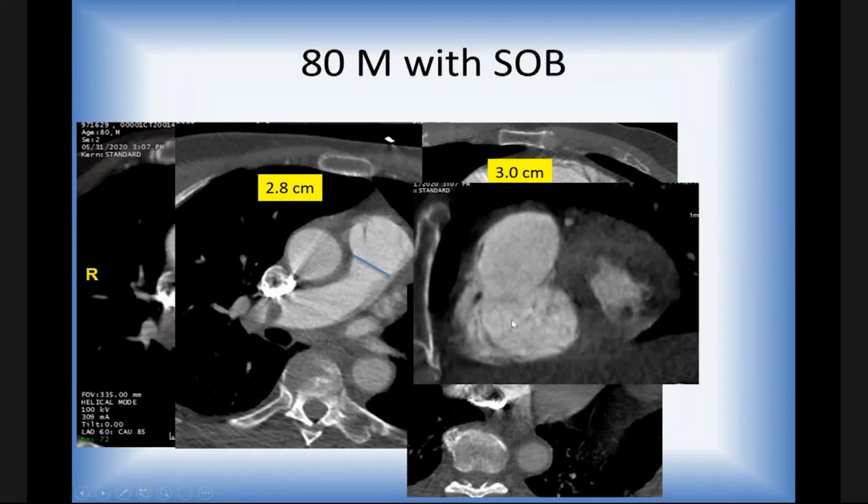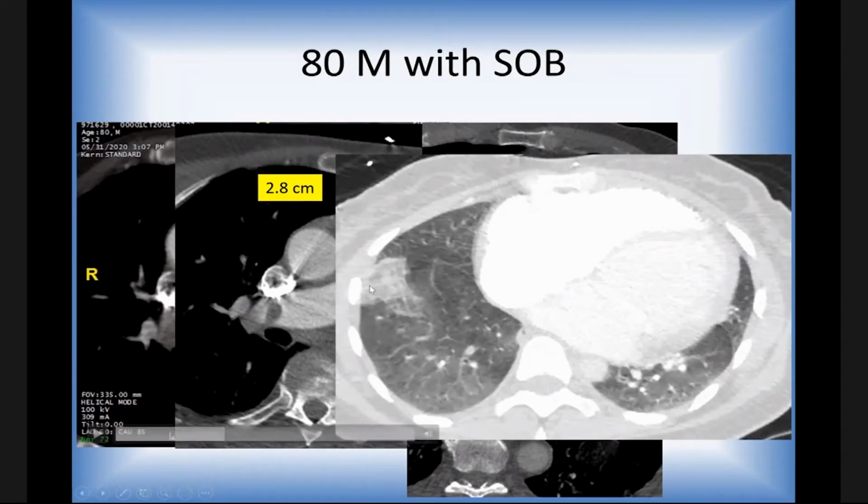Normally, the right heart should not be bigger than the left heart. And also look for the pulmonary infarction here.